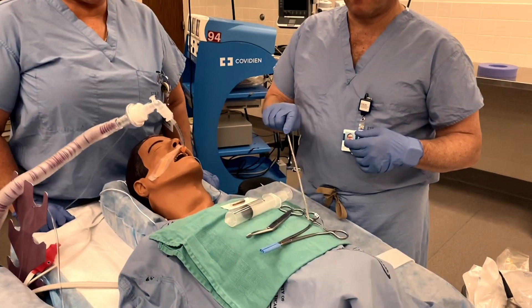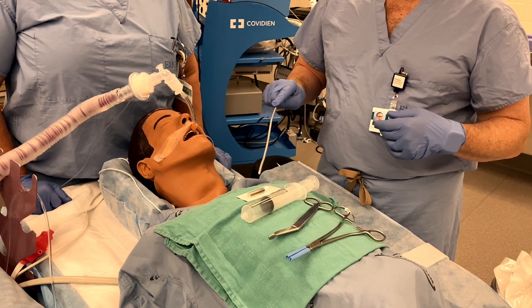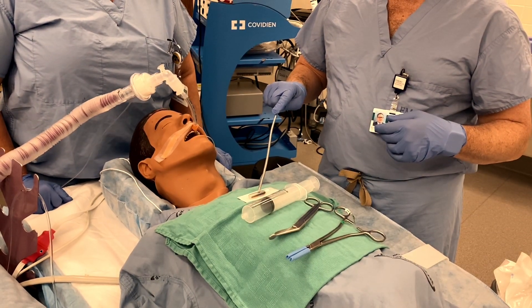What you'll need for this: a clamp, scissors, a 50cc syringe preloaded with about 20 to 30 mils of air, and some benzoin or mastosol.